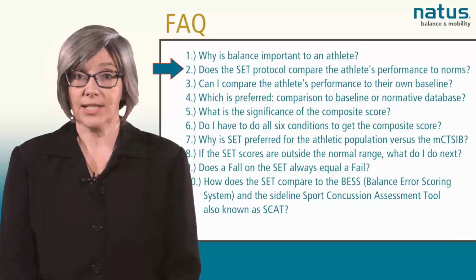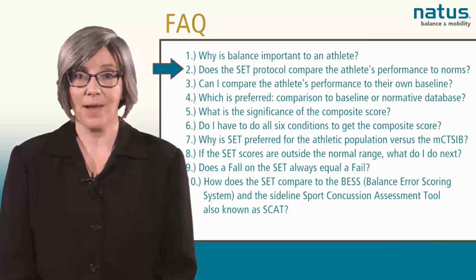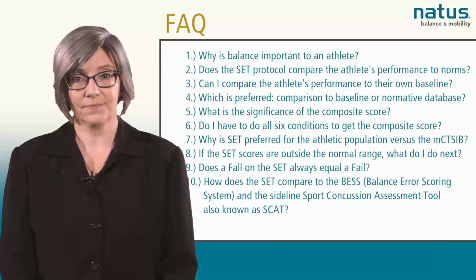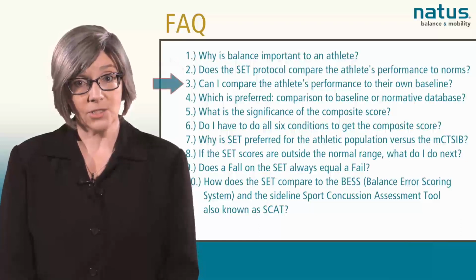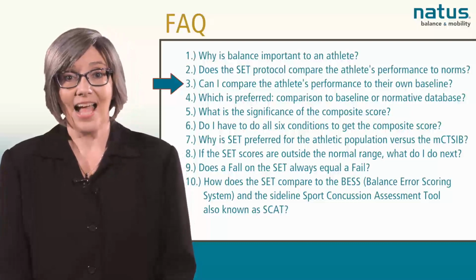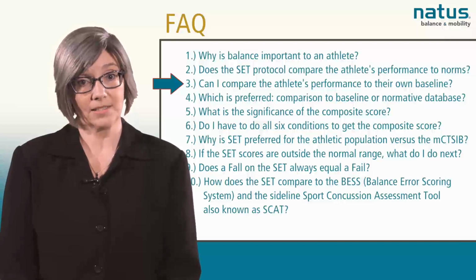The scores for an individual athlete are automatically compared against that age-matched database. Can I compare the athlete's performance to their own baseline? Yes, however, there's also a reference database to compare the athlete's performance to their peers.